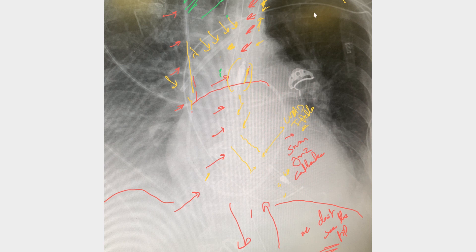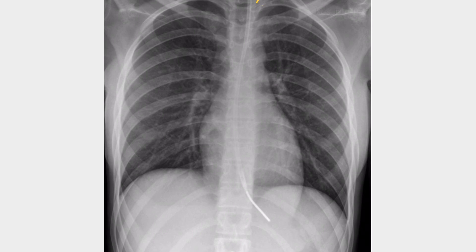To summarize: for NG tube placement, remember — cross the carina in the central/middle position, cross the diaphragm, and see the tip. Here is another X-ray showing good NG tube placement — it's central, crossing the carina, going down and crossing the diaphragm. The only issue is it's barely in the stomach; it probably needs to be advanced three to four centimeters and then repeat the chest X-ray. Hopefully these examples make it clear how to confirm NG tube positioning on X-ray.